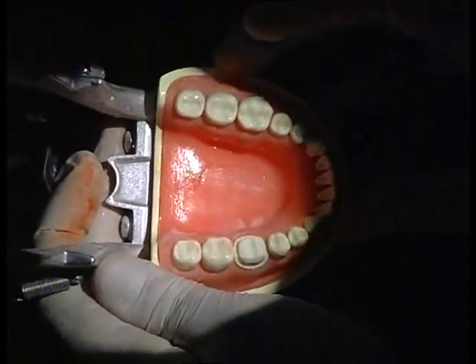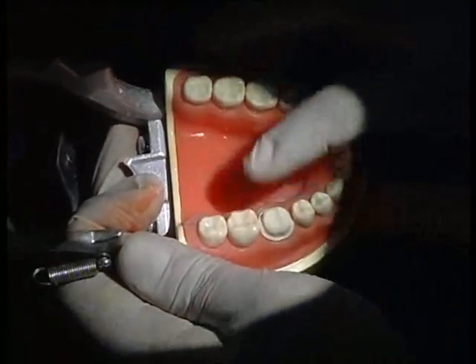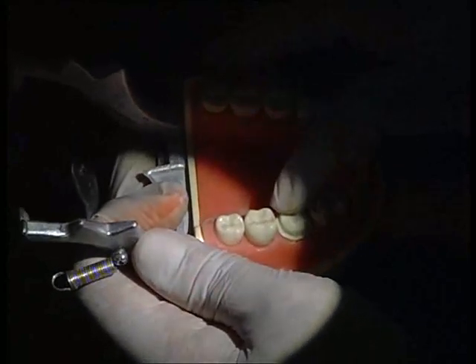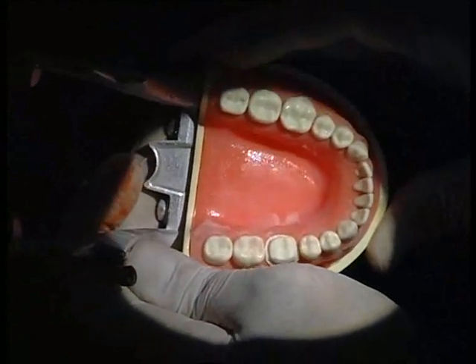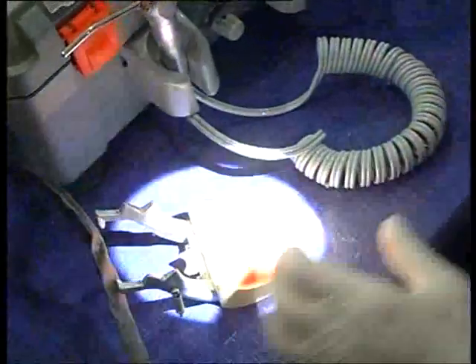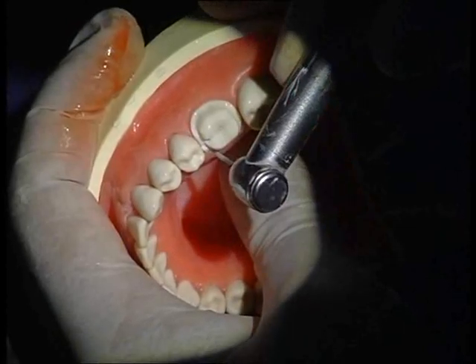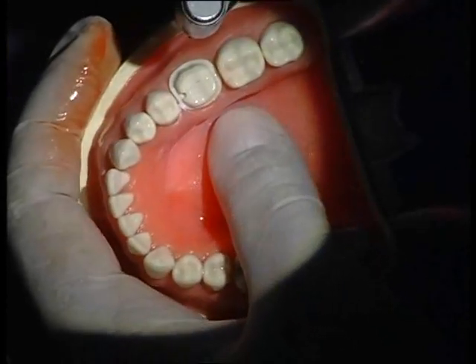We're ready at this point to make an impression. This would be a little rough because I have done dry cutting. I recommend using water — it will give you a much better, smoother finish. A groove is something I'd like to give with my radial shoulder burr — can you see a groove developed there?